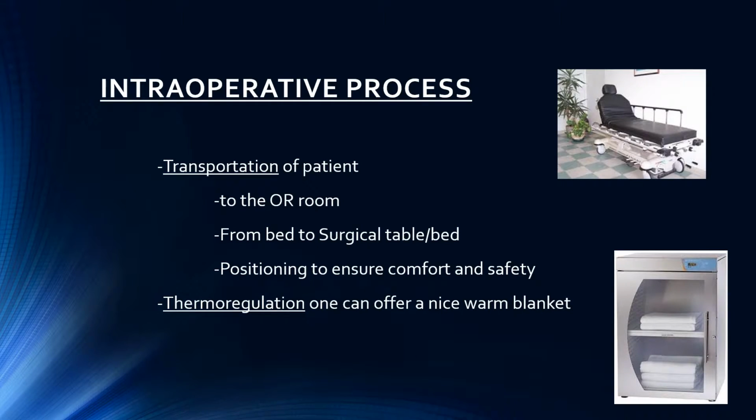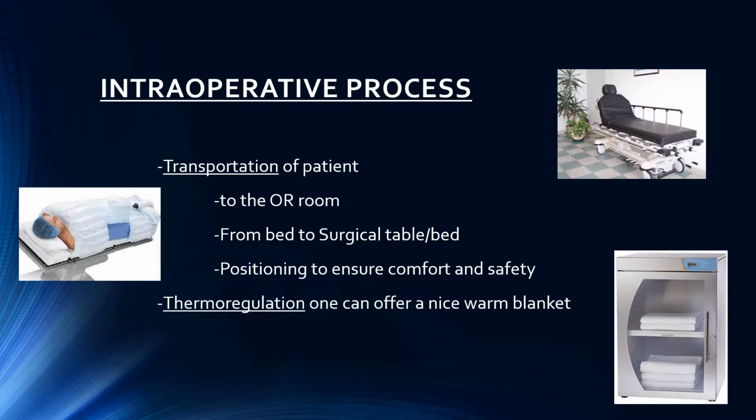Again, thermal regulation. Most patients come in with a thing called a bear hugger, and the bear hugger itself is a warming device that blows nice warm air. Usually the patient's in pre-op waiting for the operation to happen, and while they're waiting, they're connected and they're warm, but that bear hugger does not follow them. They end up getting disconnected from it. So from the time that they leave the operative area to go to the operating room, they may get cold. The operating room itself is cold.